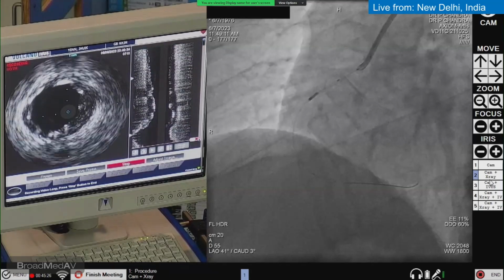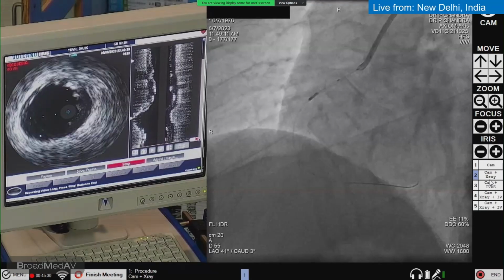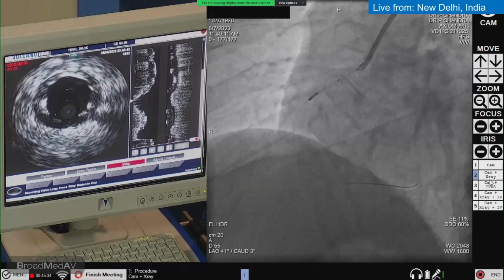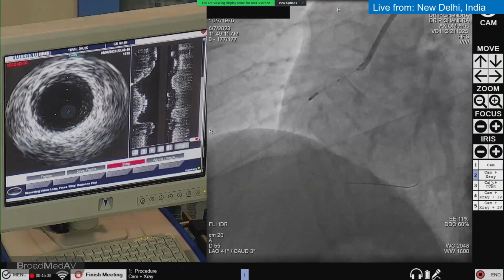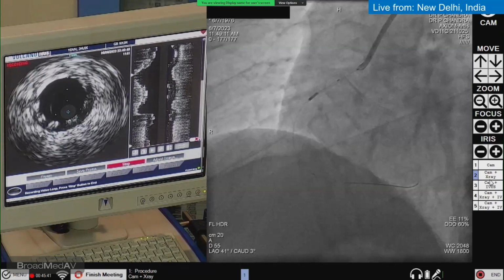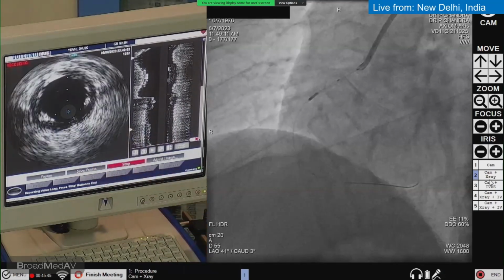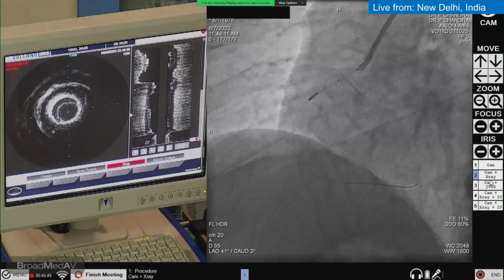The stent is very well expanded. I think proximally it is absolutely fine. And the distal edge I am going to check again. Middle is okay. Yeah. Okay, I think it's okay. Maybe a little bit we can do. Yeah, it's okay. Give me a 4.5.